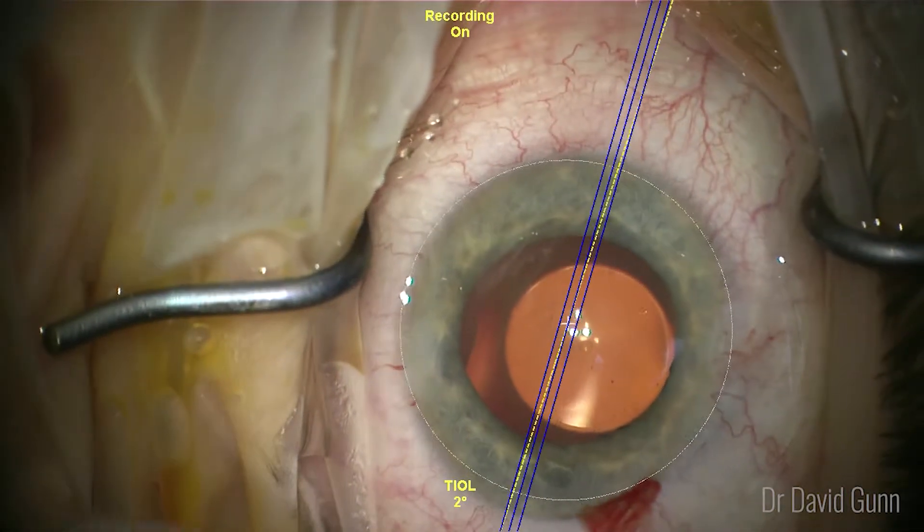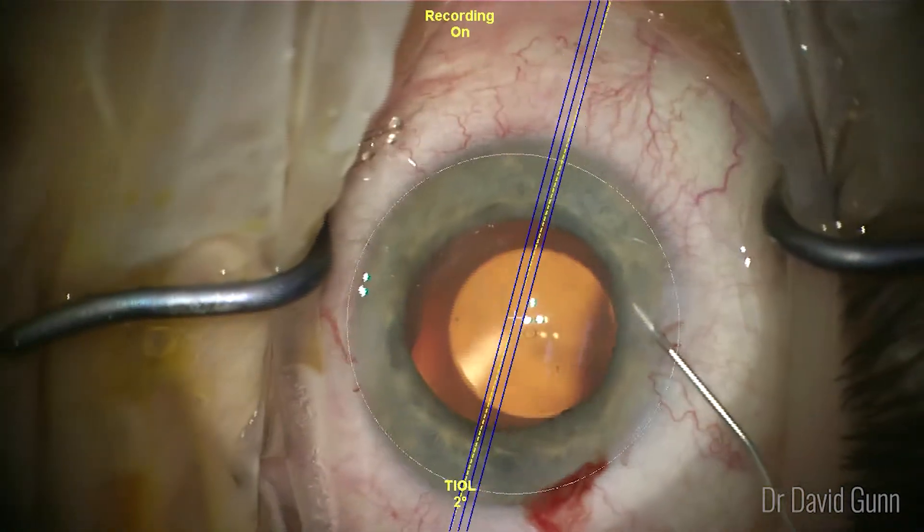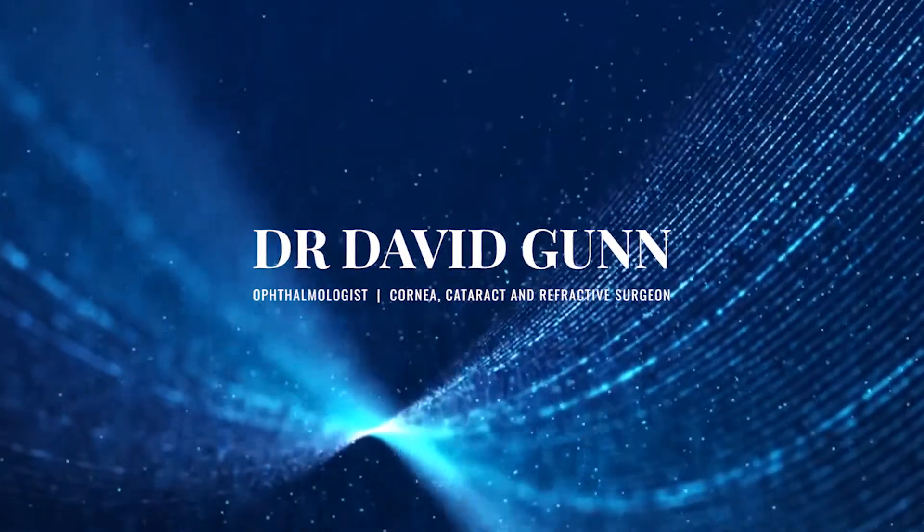Here I'm checking the alignment — happy with the position. This patient had an excellent outcome with 6/5 vision uncorrected at week one. Thank you very much.